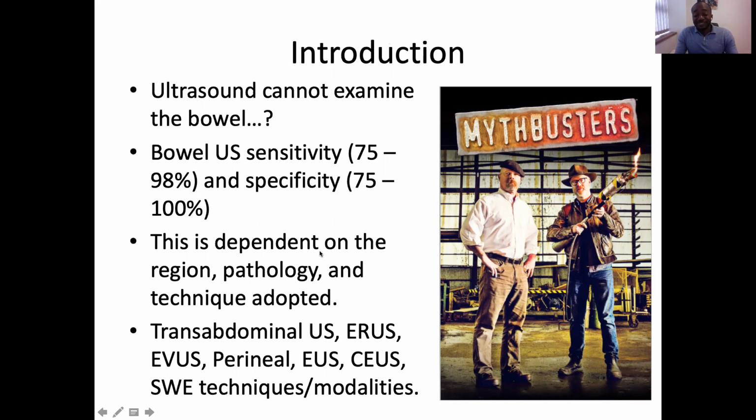Ultrasound in the past has always had this myth among sonographers that it cannot examine the bowel. I carried out some research sometime last year among sonographers regarding their interest in bowel ultrasound, and it was interesting to find that a number of sonographers still believe that ultrasound cannot examine the bowel due to bowel gas. And we still carry on that mindset. I want to hope that we are all here today because we believe ultrasound can actually examine the bowel.